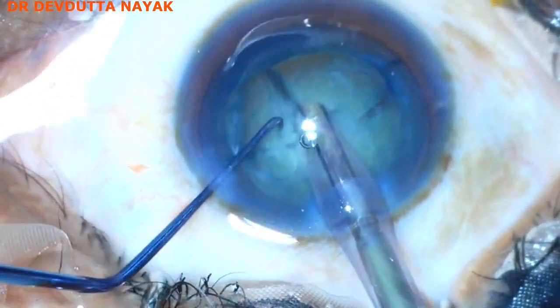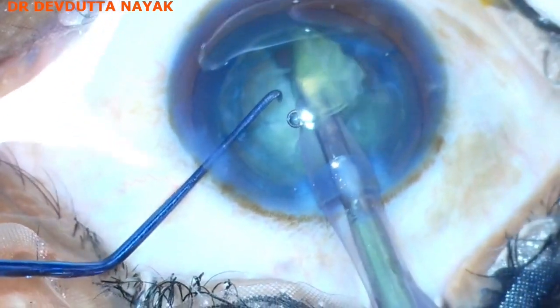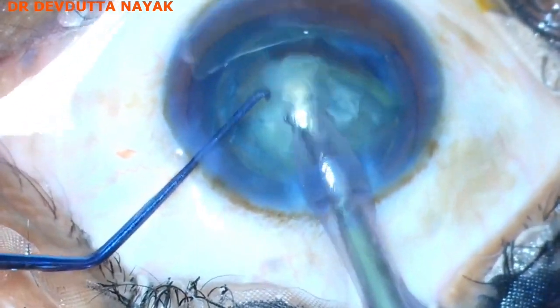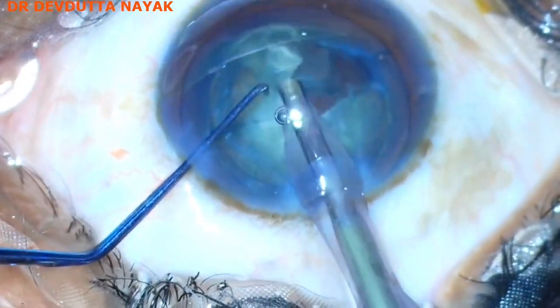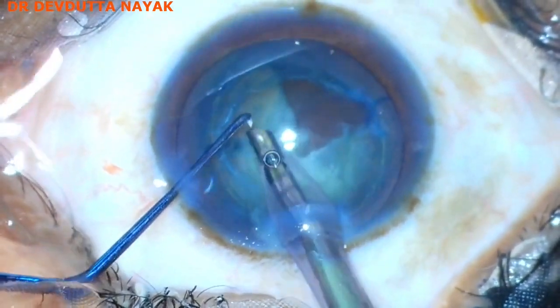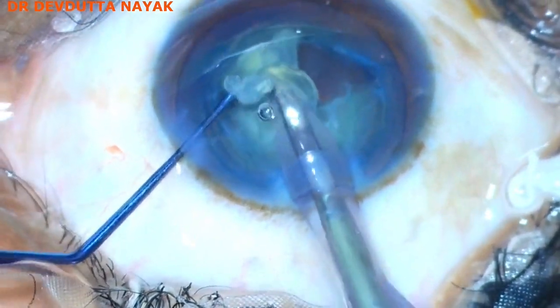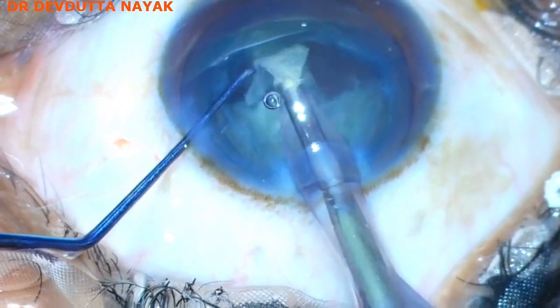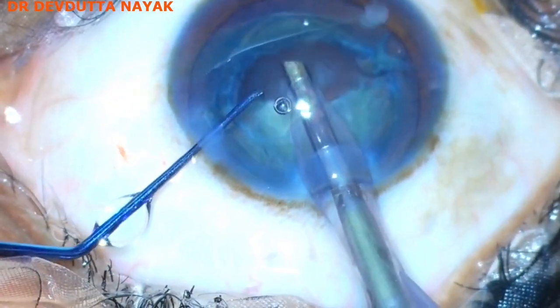Now we proceed to pulse mode to emulsify the pieces. Vacuum is 400, aspiration flow rate is 32, and phaco power being employed is 40%.